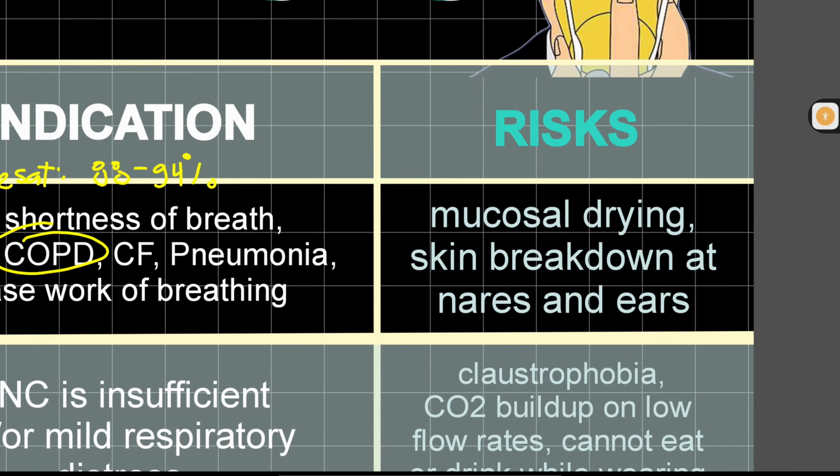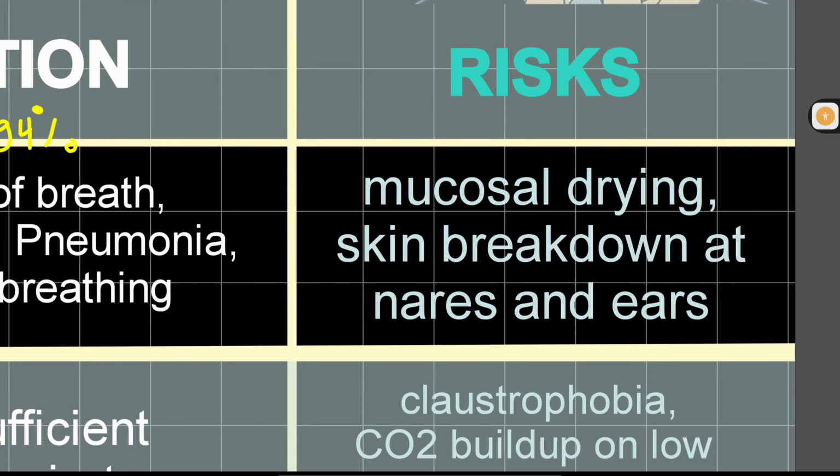All right. Moving on, what are the risks of using a nasal cannula? We have here mucosal drying, and skin breakdown at the nares and ears.